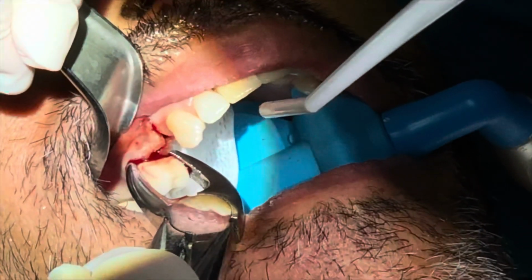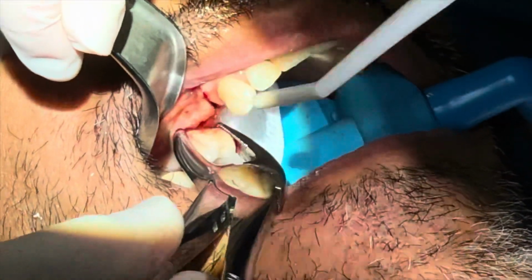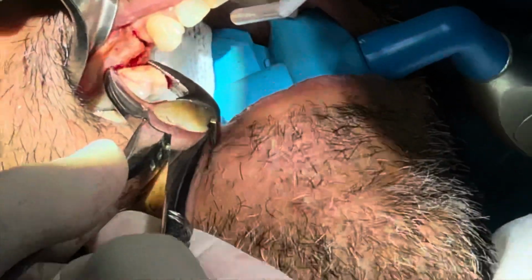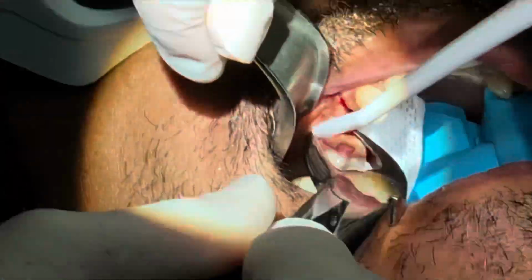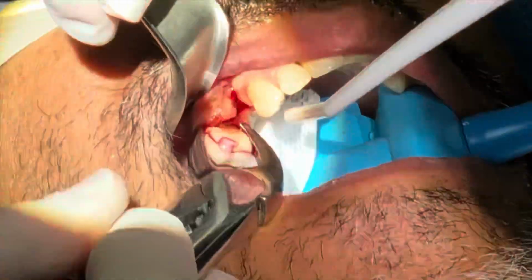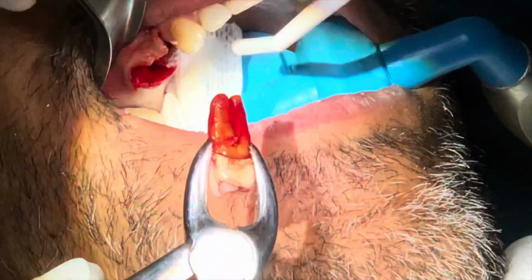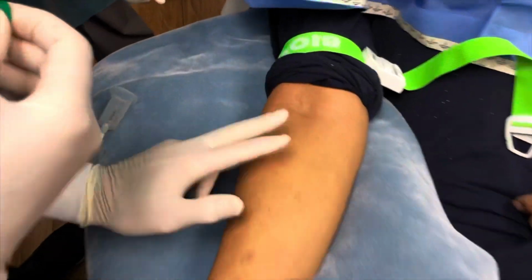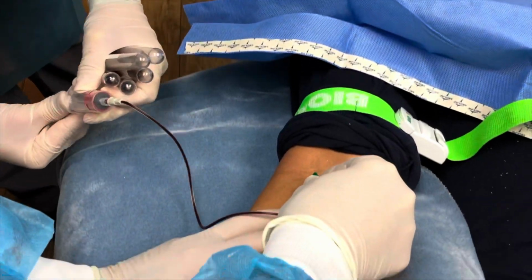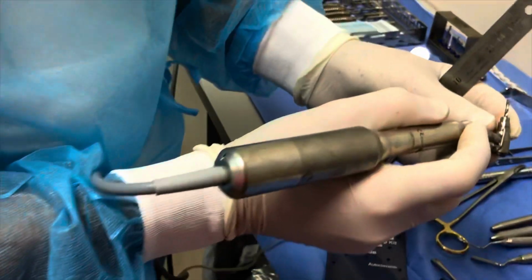I'm just teasing the tooth, a little wiggle, a little buccal lingual and rotational stretching of the bone, and eventually it will come out. You shouldn't apply too much force. This is a good time to draw some blood to spin and obtain some PRF, or platelet-rich fibrin, which we will use with the graft material. A little more about that later.